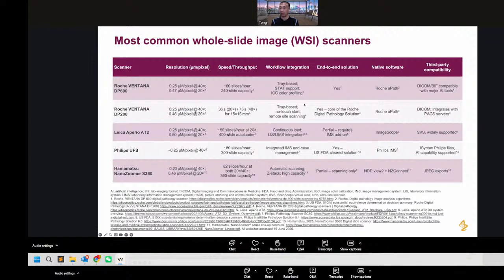And it could be lower. For example, the scanner cost could be lower, maybe from 500K down to 200K or 300K, depending on which company or which area. Like in China, some manufacturers have a fairly low price point compared to some of the US-based ones.